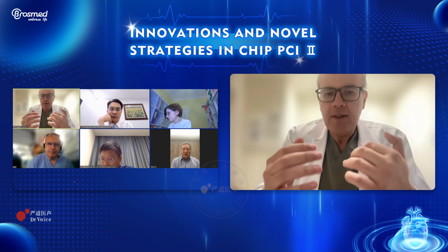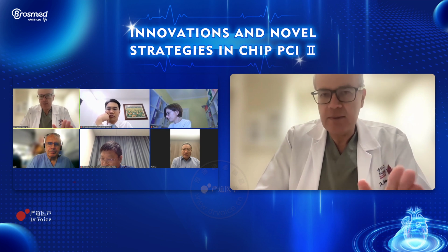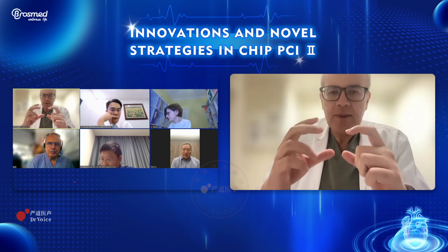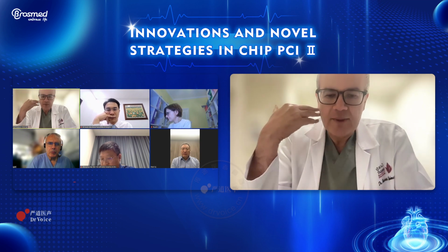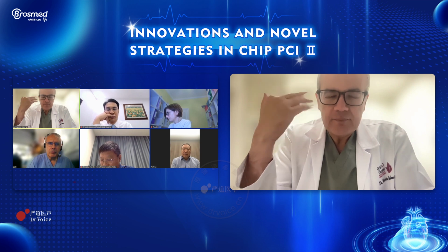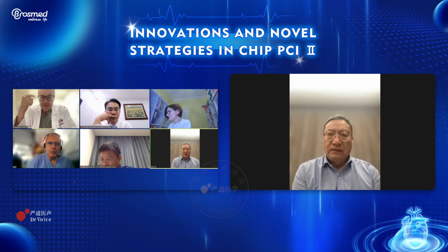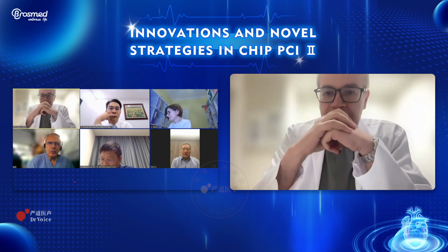Now we will do a balloon angioplasty, whether non-compliant, semi-compliant, scoring, cutting, whatever. And I'm now going back to the old work from the 1980s, on plaque sealing by angioplasty. I forgot the name, it's a very famous guy.